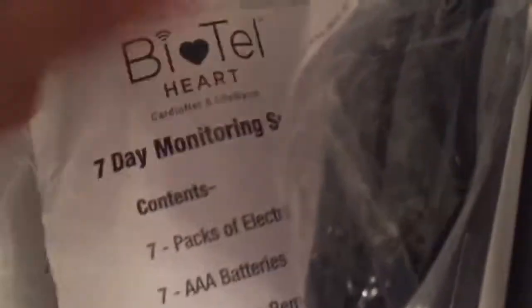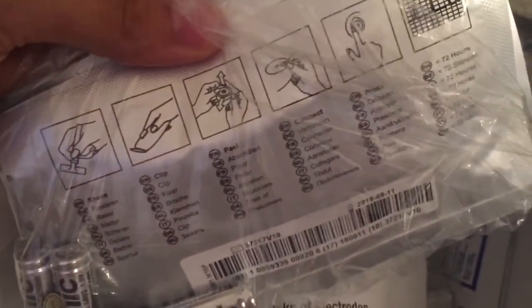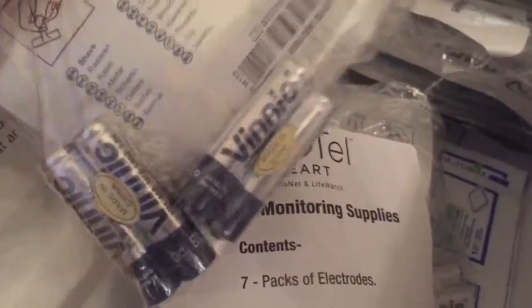I just got this little sucker in the mail the other day. It looks kind of intimidating, but once you actually get used to it or read the instructions, it's not that complicated. These are the little packs of electrodes that I need to put on my chest, the batteries, etc.